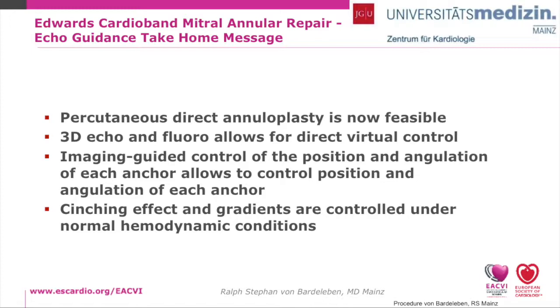So the first question, there is a certain detachment rate. There are 44,000 procedures done, and to my knowledge, the total embolization rate is less than 3 cases. There is a so-called partial detachment, which, when users were more inexperienced, was as high as 6 to 7%. Partial detachment means the clip is only attached to one leaflet and detaches from the second leaflet. This nowadays happens less than 1%, but it's still possible.